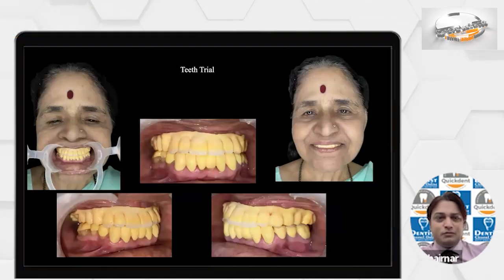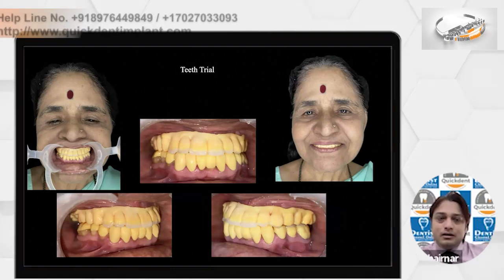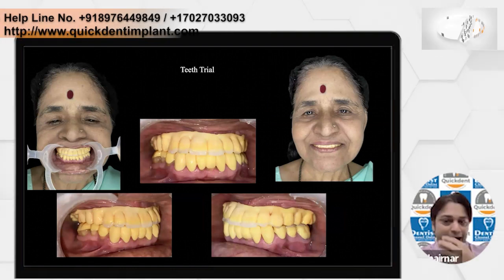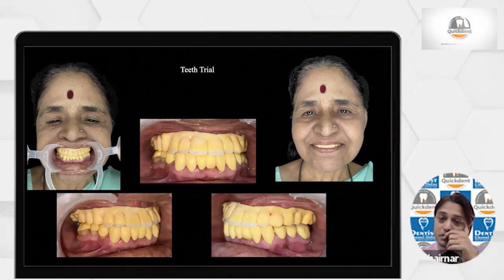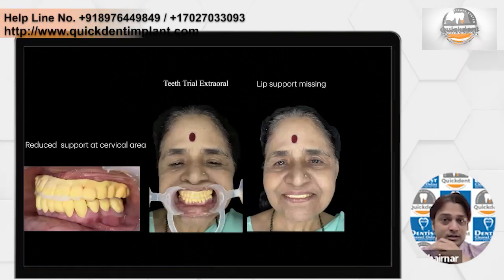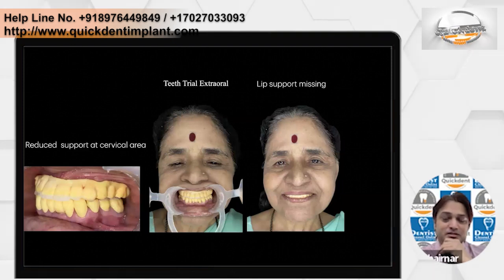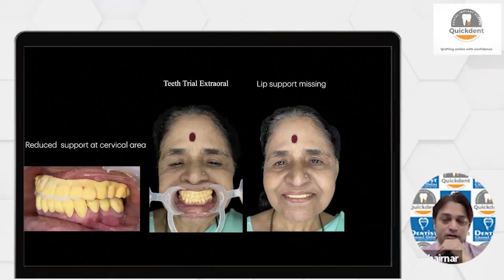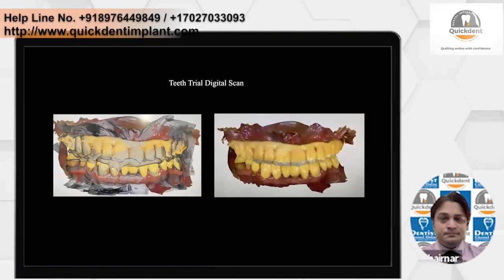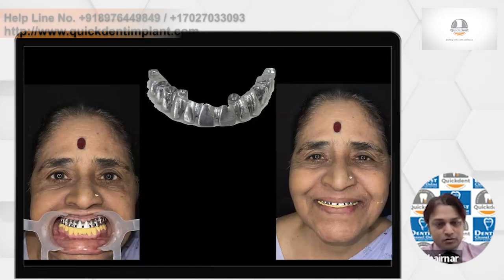Now what we thought, the teeth are very short, so we will add certainly some composite just to give them a guidance that this should be the projected length of the incisors and the lateral incisors. Everything okay. Now this has been sent to the technician. Here also we did the scan and we send it to the technician. All fine. He just made the metal trial according to this.